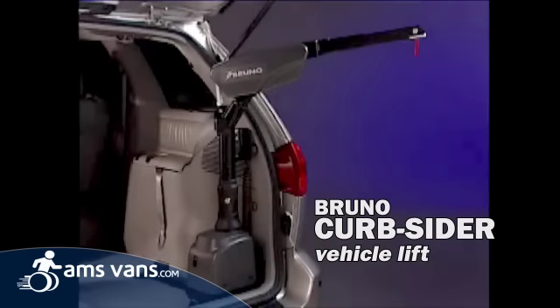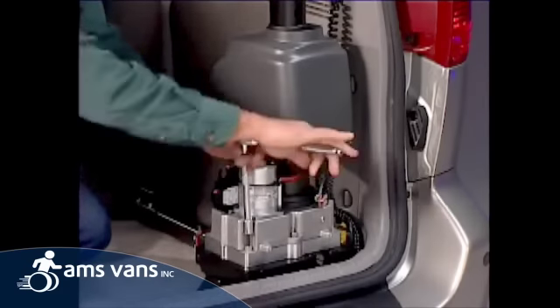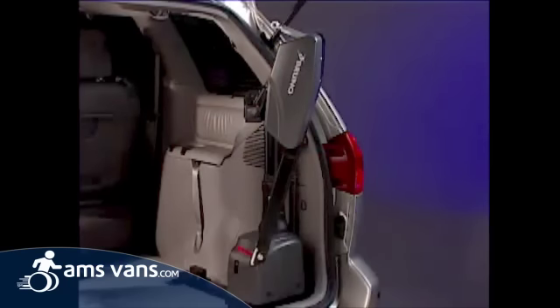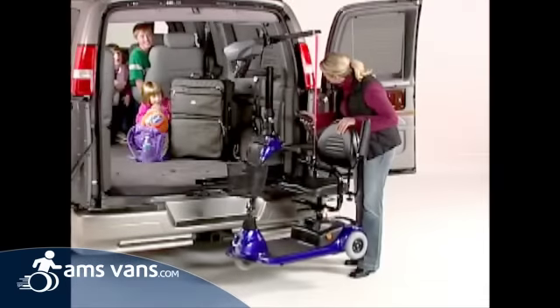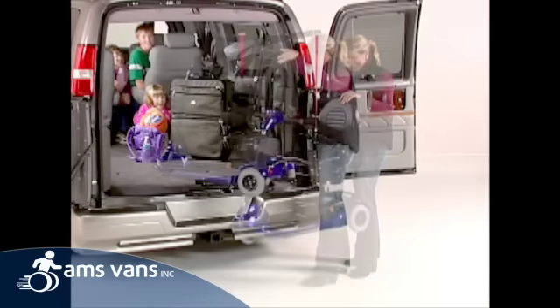Curbsider by Bruno — the epitome of interior vehicle lifts. Modular versatility, superior direct gear drive performance, gracious styling, unequaled adaptability. That's right, the Curbsider is still the undisputed champion for total performance.